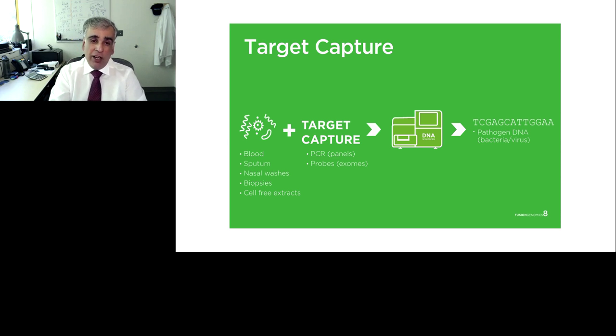Either it is there or it is not there in a binary sense. And it also becomes absolute because you are sequencing, you're obtaining directly the genomic sequence of whatever you are trying to capture. Now, before I go any further, I thought it might also help the audience, and I'm pretty sure that most of you are already aware of it.